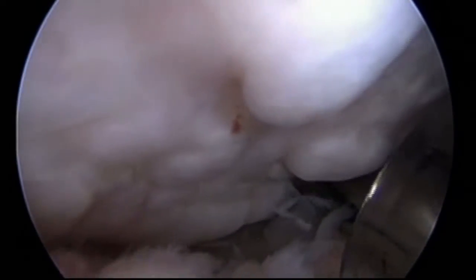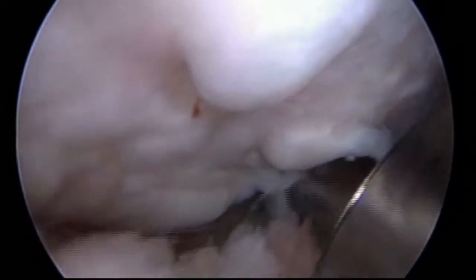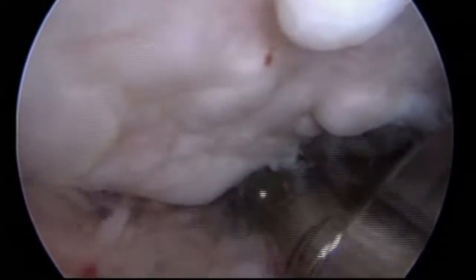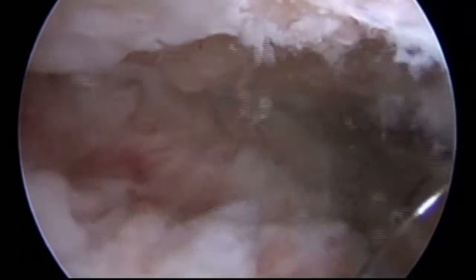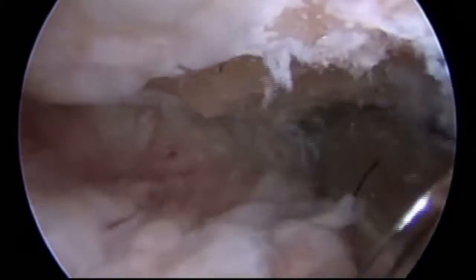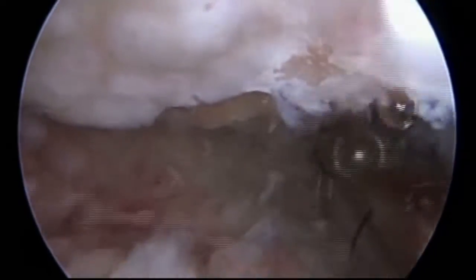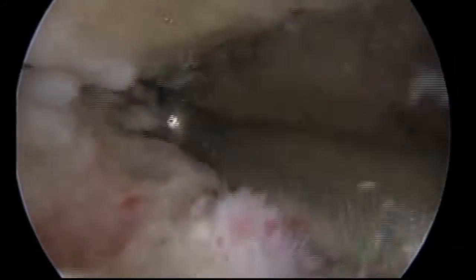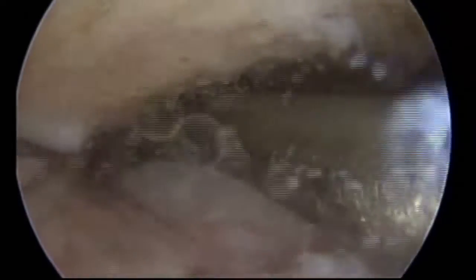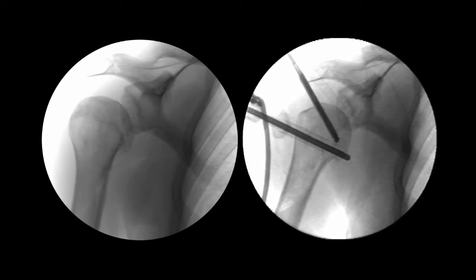The intraarticular inferior humeral osteophyte is resected using a shielded arthroscopic burr and arthroscopic shavers. To ensure adequate bony resection, the arm is internally and externally rotated during the procedure to bring all areas of the osteophyte into view of the arthroscope or within the plane of the fluoroscope. Curettes are used to remove hypertrophic bone from areas more difficult to reach with motorized instruments. Sufficient resection is verified with the fluoroscopic C-arm.